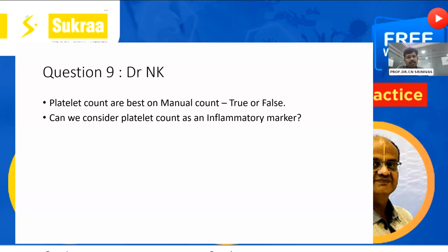For the second question, yes, I am seeing a lot of cases, definitely in sepsis, wherein platelet counts are coming high. The other well-known instance is treatment of iron deficiency anemia; as a response to increasing hemoglobin, platelets also tend to increase. So those are my views.